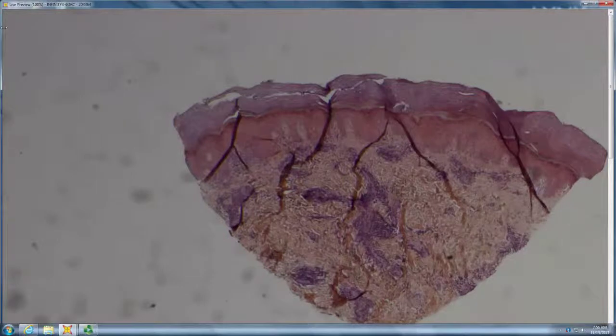So, I mean, it's very pale staining, but I can see vascular lumens. And what's in the lumen? I think red blood cells. I'm not sure. Or maybe some fibrin or thrombi. Yeah, so probably thrombi. You've got 1 or 2 neutrophils, but not a whole lot. You've got fibrin thrombi, and a lot of the fibrin is not in the lumen, but sort of in the wall; the wall is thick and hyalinized.